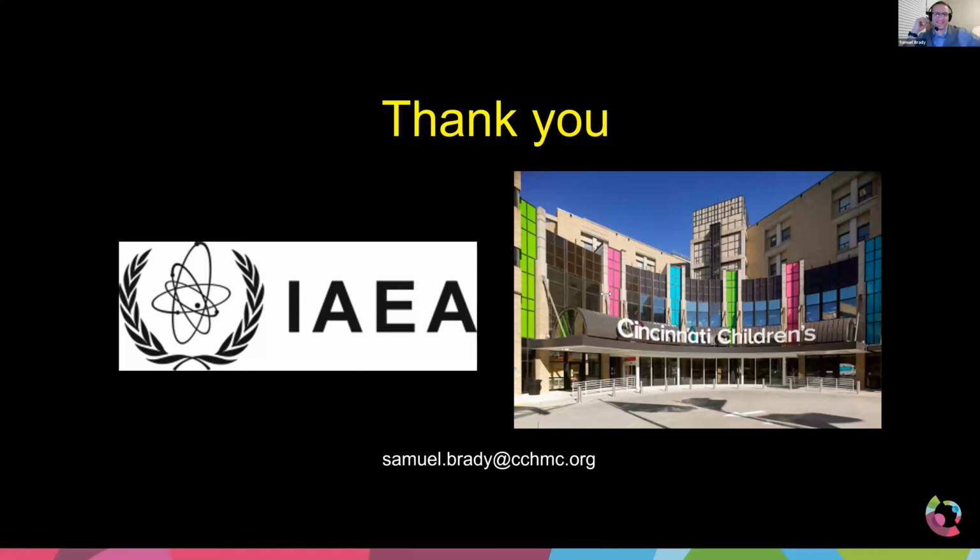That's true. I have a couple of questions. Based on your two lectures, if we want to write some manual for the technologists or for the radiologists to understand the basic principles for optimization, can I say the first thing is to put the patient in the center of the gantry? And the second thing is you need to know the final images you want to review, like a bone window or soft tissue window, or which one is the most important to you. By that way, you can choose the correct filter or kernel to process the image. So the answer is yes.